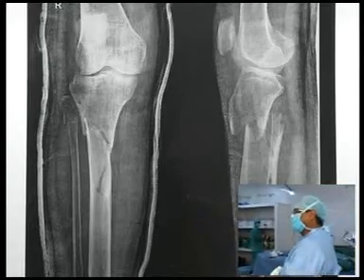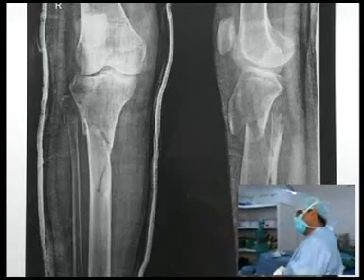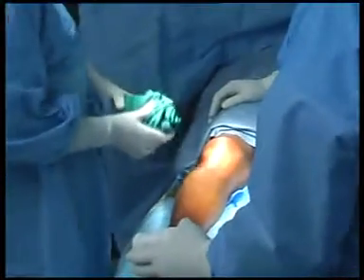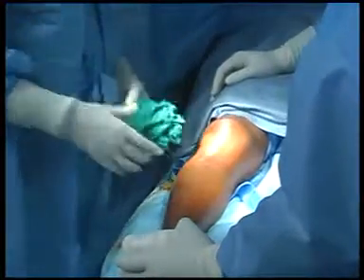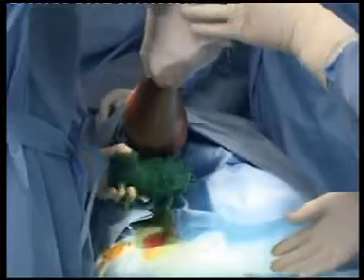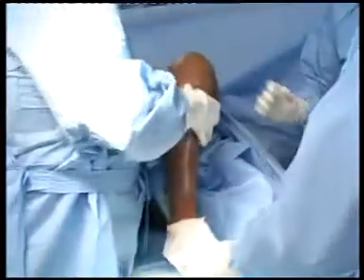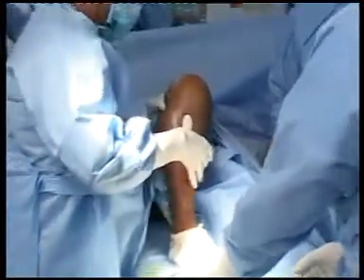I am also for plating. The end of tibia is pushed in front. I think you are able to see the picture now. What I am going to do is I will keep the knee joint in flex in this fashion — the assistant will keep holding in this position.